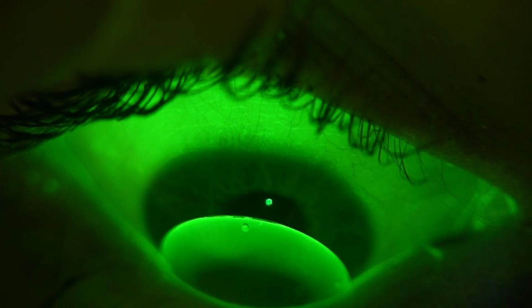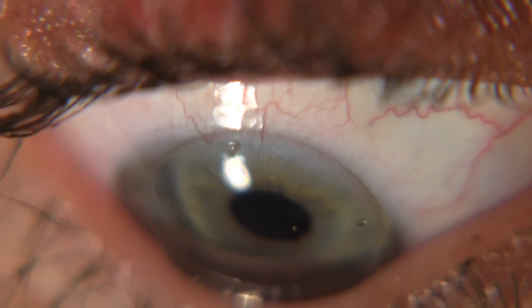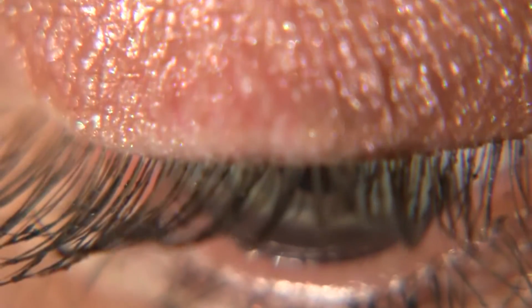Sometimes you'll have a lens that isn't translating enough. When you evaluate the lens at the slit lamp and you lift their upper eyelid to evaluate translation, you'll notice that the lens has slipped below the patient's lower eyelid. To fix this situation, you can increase the lens overall diameter to make the lens interact with the eyelids more to improve translation, or you can increase the base curve radius. This will also increase lid interaction with the lower eyelid so that it is supported when the patient looks down to allow for better translation.